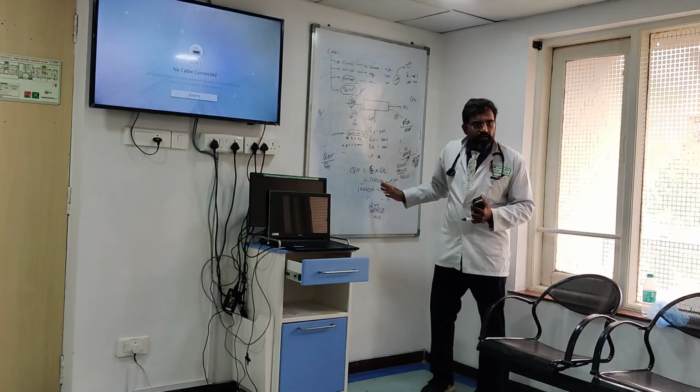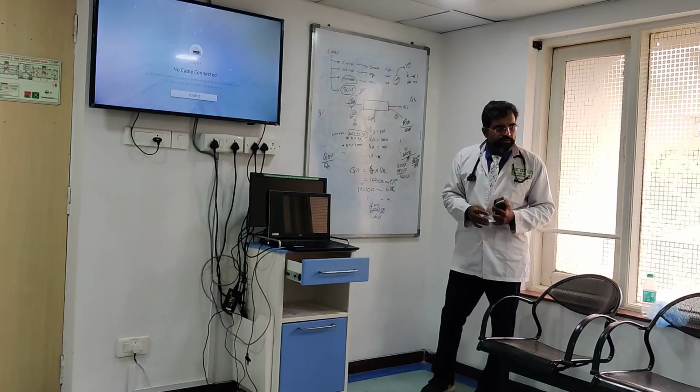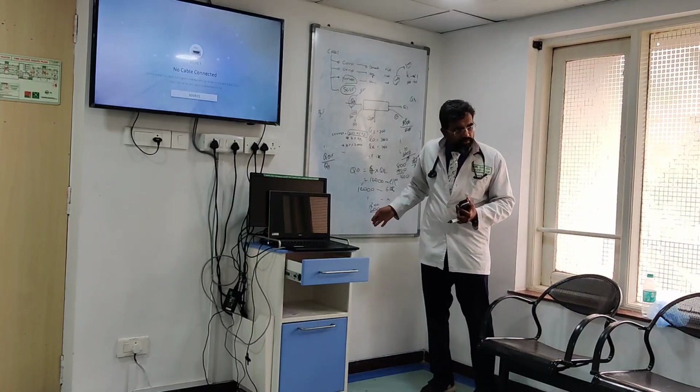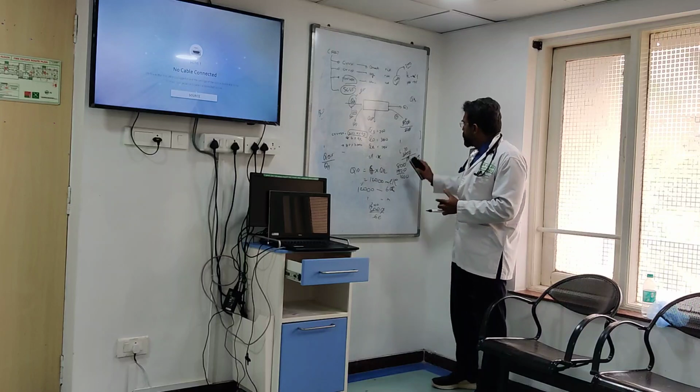That's pretty normal. 800 and 800. So that's my starting point. It's actually low. It's actually high. 25 is enough. 800 is enough. You got the point? Now let me give you another scenario.